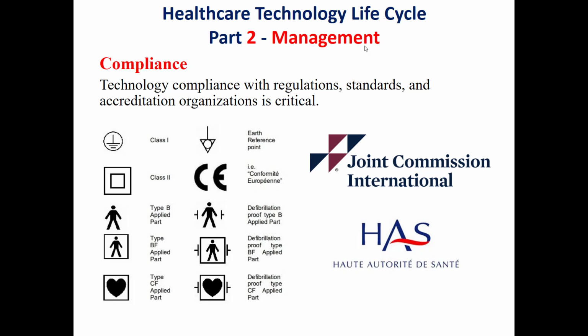The compliance will be with the regulations, the standards, and the accreditation organizations, and this will be essential and critical. Here an example of what guidelines or standards. Here we can see the IEC standards for medical devices. Here also is another example about accreditation organizations. One of the most important of them is the Joint Commission International, or what's known as JCI. In Lebanon we have what you call the HAS.